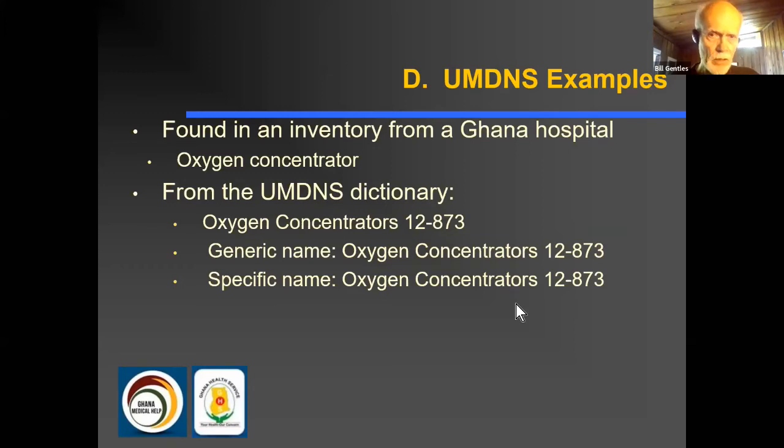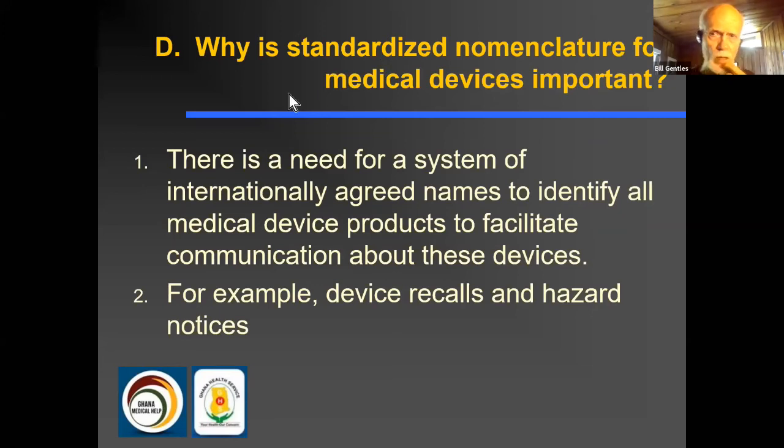So that's the last example I think I have. Now I'll talk a little bit more about why it's important to have this standardized nomenclature and use it whenever you're developing your inventory.